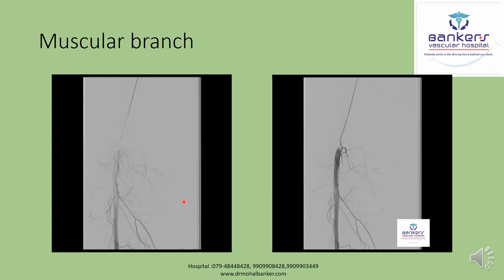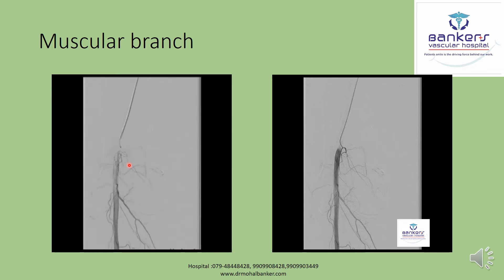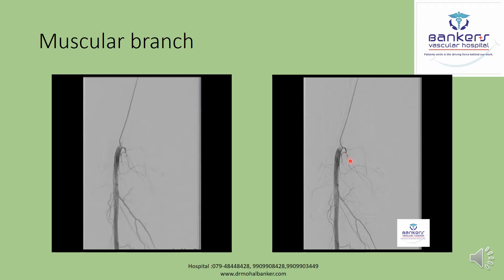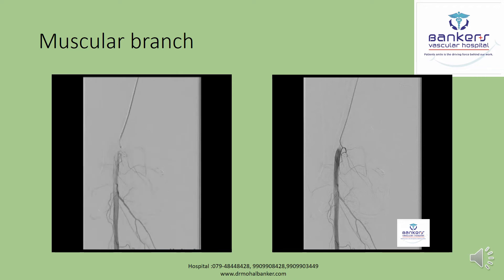Again, during angiography of different vessels, I found a muscular branch and out of curiosity performed angiography of this branch to rule out whether it was participating in the inflammatory reaction. You can see contrast flowing within this muscular branch, and one small branch does supply the pain-producing site, but there is no hypervascular blush. So this muscular branch is not participating in cytokine release.